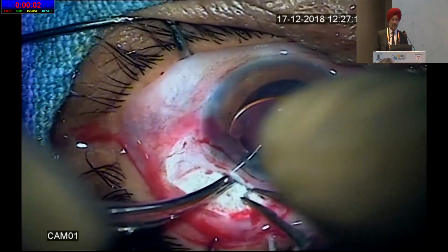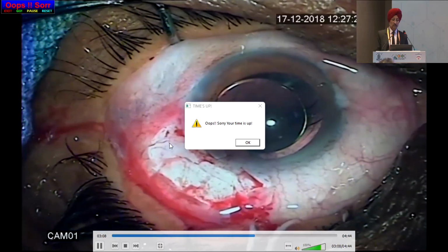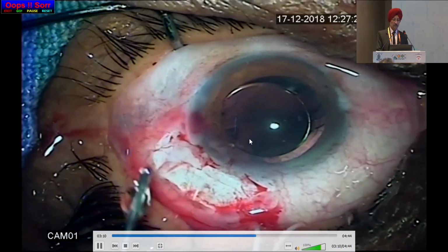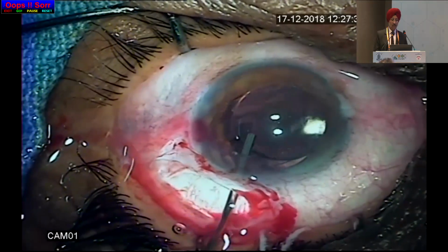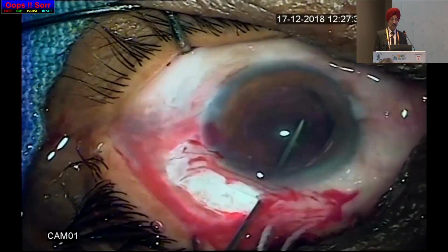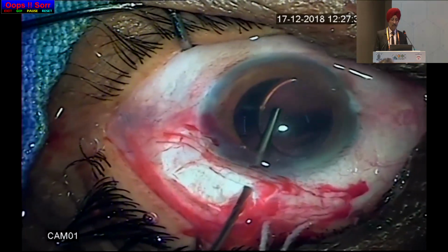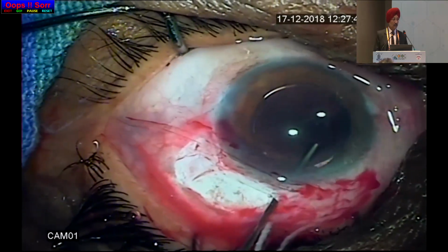Anterior chamber is formed with viscoelastics. This is an aspheric hydrophilic IOL that we implanted with IOL holding forceps only. In SICS there is no need to squeeze the lens into an injector. Take care that the leading haptic goes into the bag. The trailing haptic is gently guided into the bag with a button dialer or visco cannula itself.